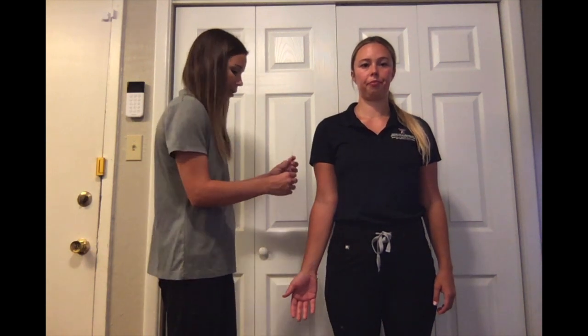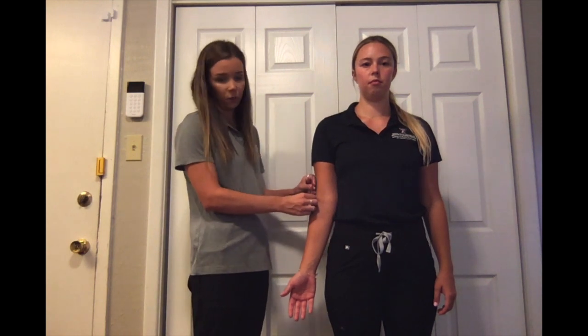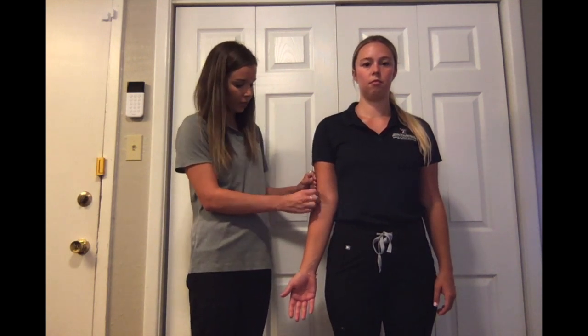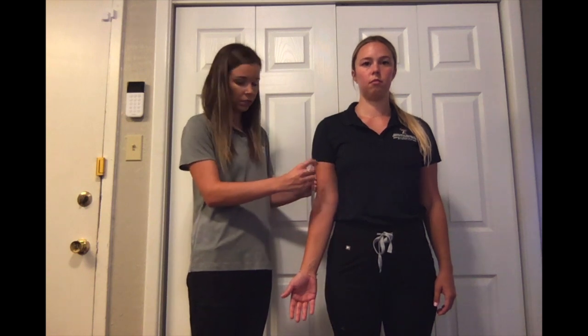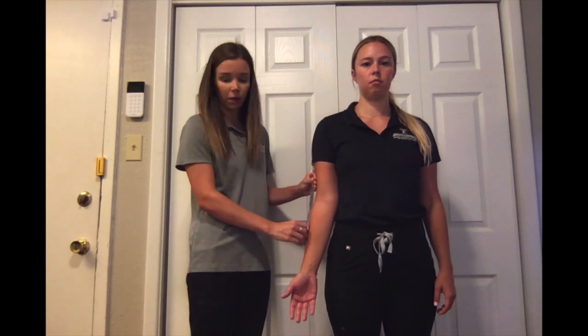To measure the range of motion for elbow flexion, the client is going to be positioned with their shoulder adducted and their elbow extended. You're going to place the axis of the goniometer in line with the lateral epicondyle of the humerus. The stationary arm is going to be parallel to the humerus and the moving arm will follow the radius.